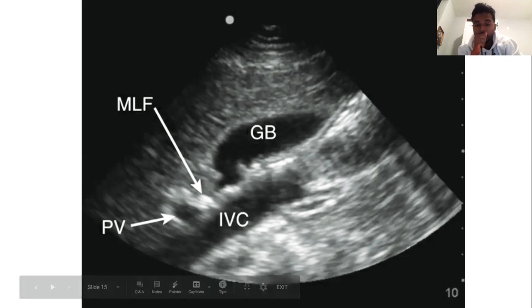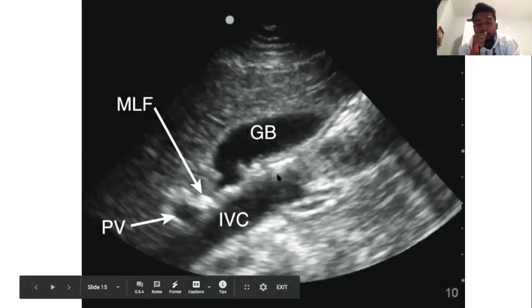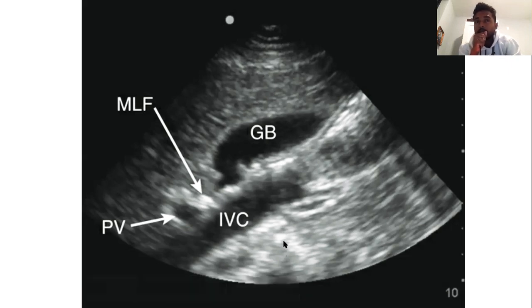So it has an optimal focus area where it gets perfect resolution. As it gets deeper and the sound wave loses its frequency and strength, it loses resolution. It brings back signal, but it's not good at delineating.